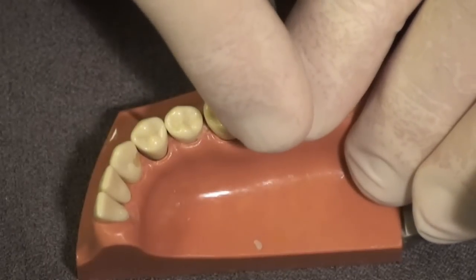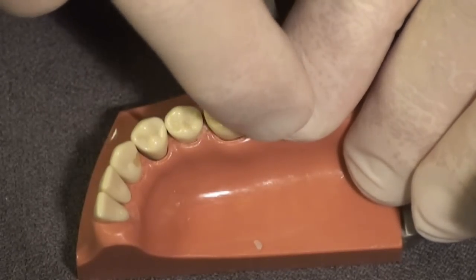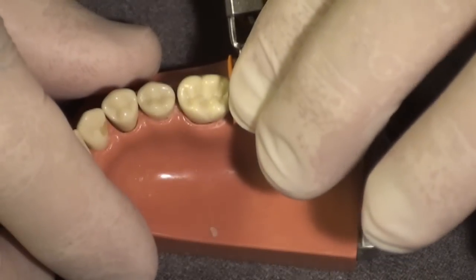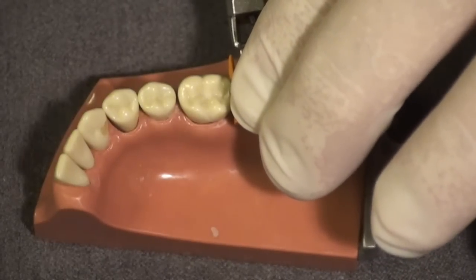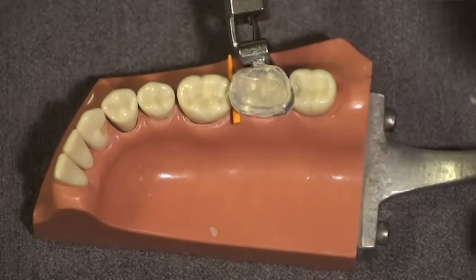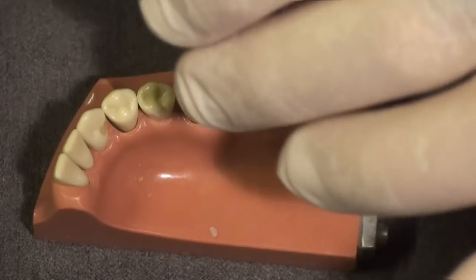I'm putting about 5 pounds of pressure with my finger for 5 to 10 seconds, forcing the composite into its original shape and texture with the same occlusion the patient was comfortable with when they walked into the operatory.